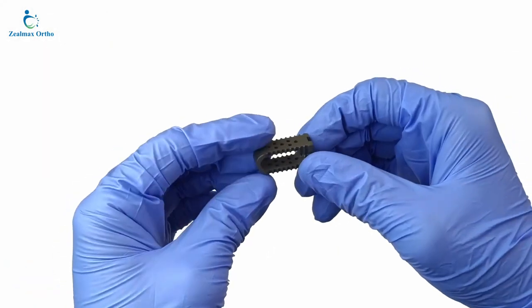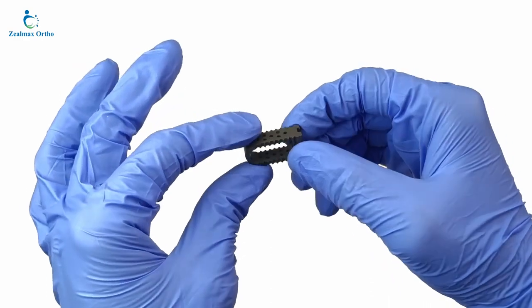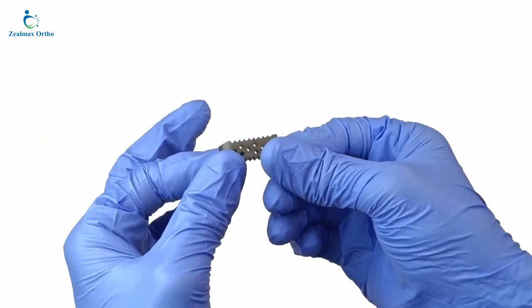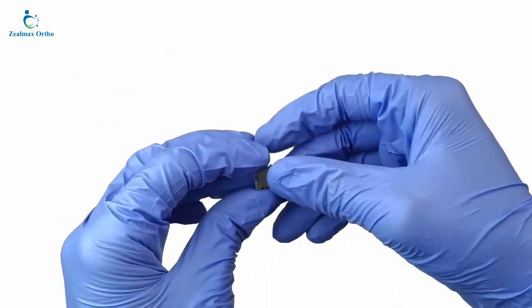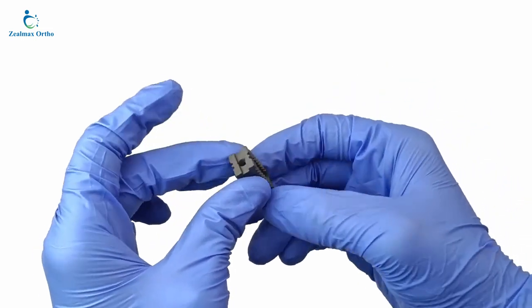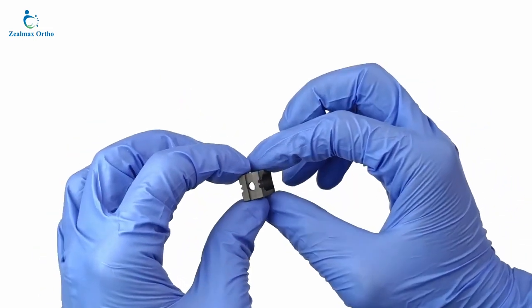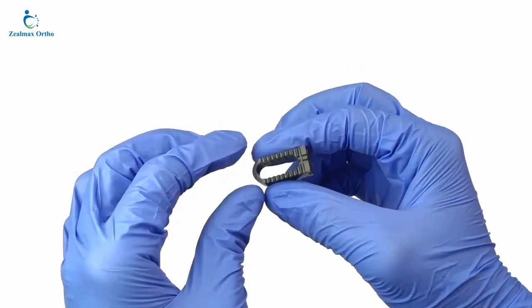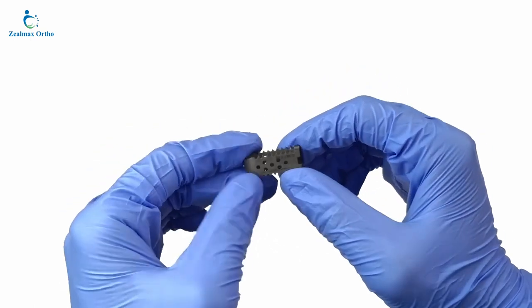The posterior lumbar interbody fusion bullet type cage is specially designed for PLIF procedures. This cage has a bullet-shaped or tapered structure that allows for easier insertion into the intervertebral space. PLIF bullet type cages offer good load-bearing capabilities and support for fusion.